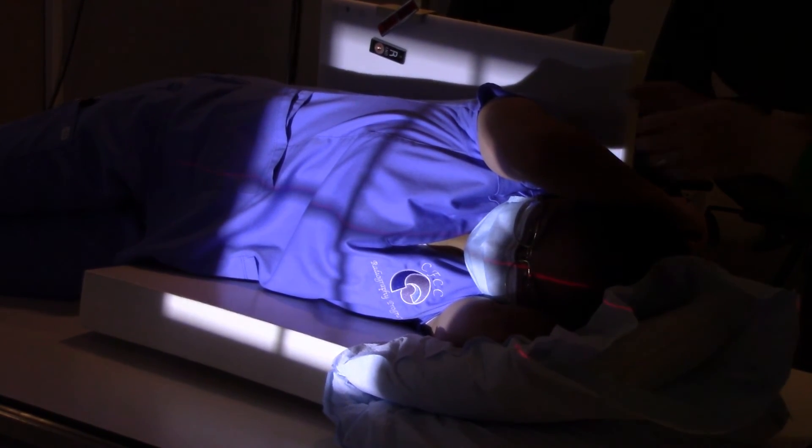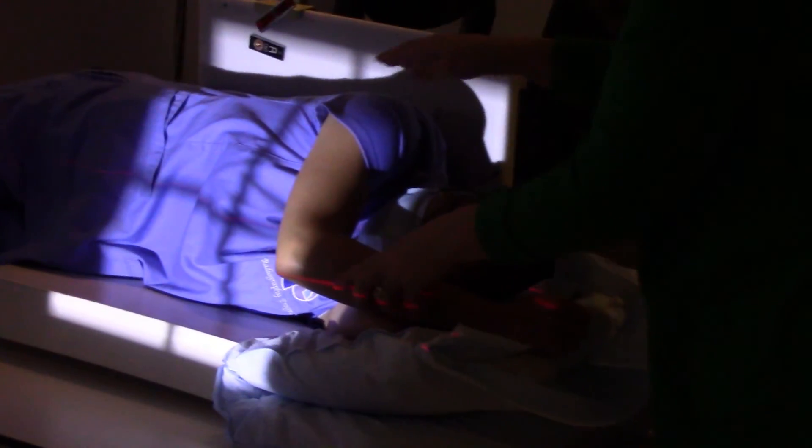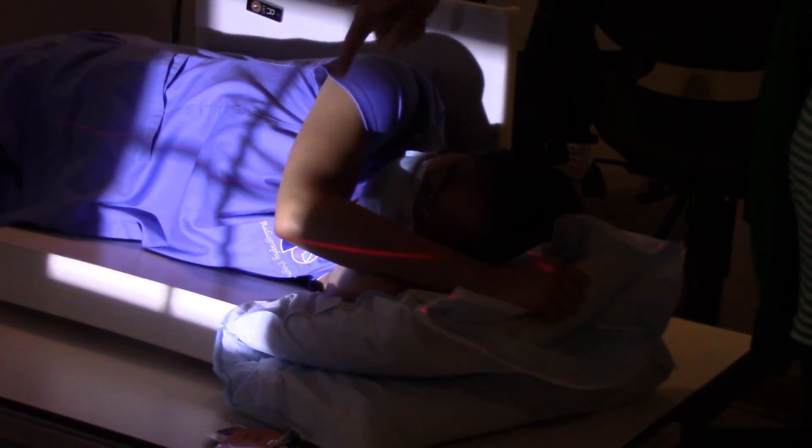Just to show you — if you don't have her shoulder, you can put the elbows in like this. Do you see how that's comfortable for patients, but do you see how that could be in the way?